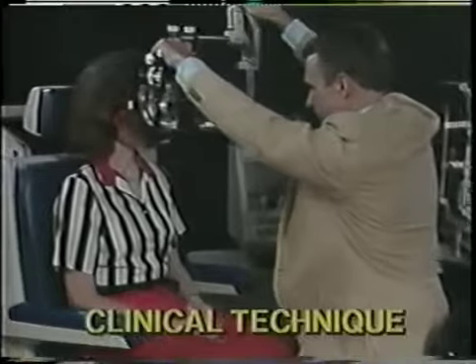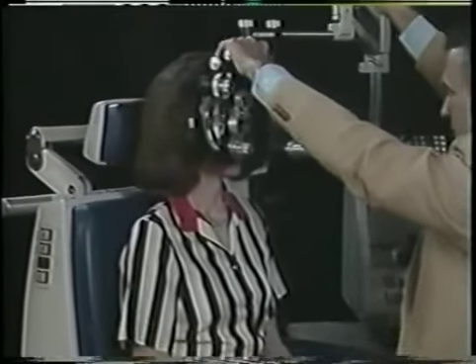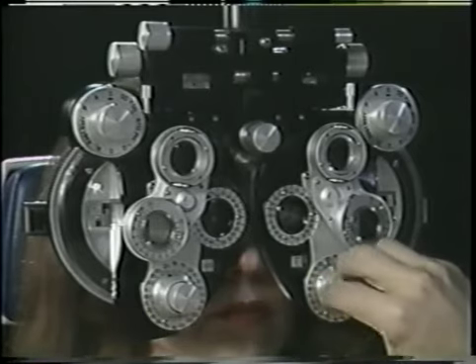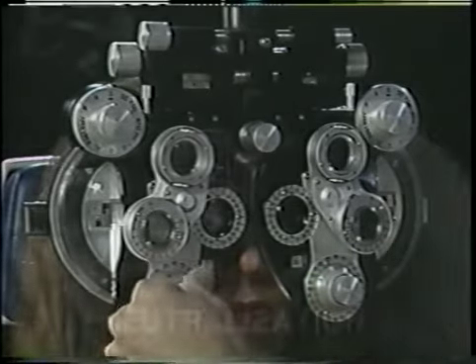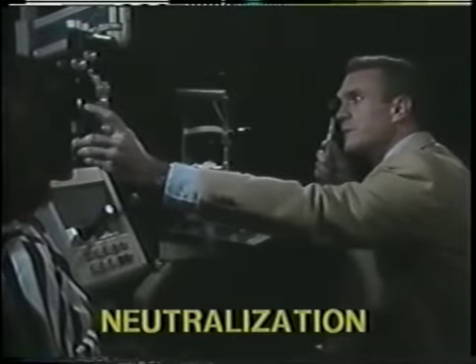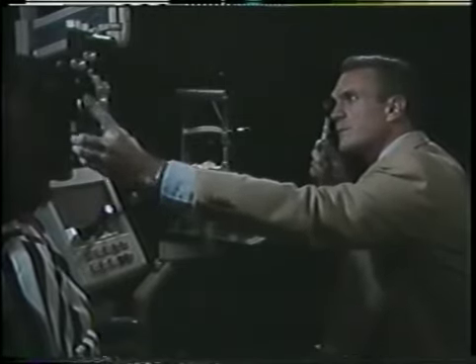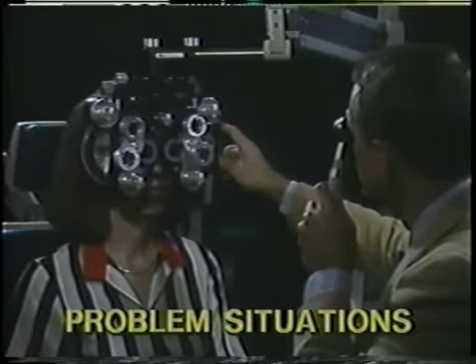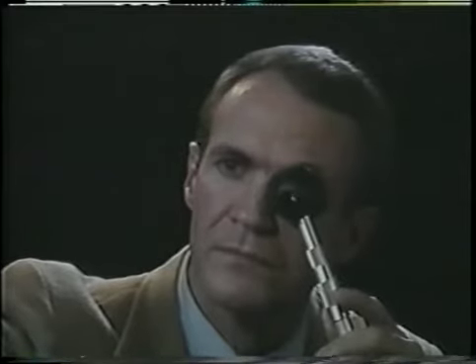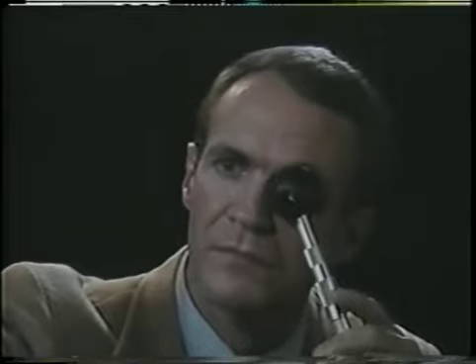beginning retinoscopist. In this program, step-by-step details of the clinical technique of retinoscopy will be described. Plus-cylinder refracting equipment will be used throughout. Those viewers having minus-cylinder equipment should obtain the alternate videotape using minus cylinders. Neutralization methods rather than estimation methods will be emphasized, both with model eyes and with actual patients. Finally, problem situations such as small pupils, irregular reflexes, and dim reflexes will be demonstrated, along with instruction in how to deal with them. This program will thus provide the background and clinical instruction necessary for the eventual mastery of retinoscopy.